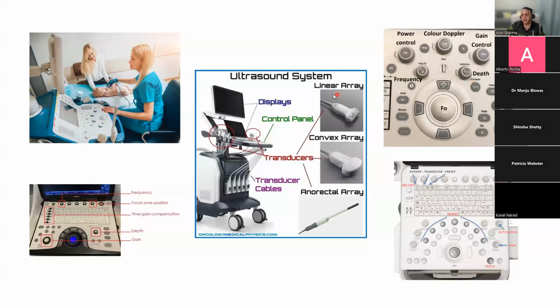But if you have a focus button, then really the focus button is usually, when you start in coronal plane, placed at the level of the corpus callosum or the ventricular system. And in the sagittal views, what we normally say is we like it placed at the level of the ventricles. And that will give you reasonable resolution to be able to see both superficial and deep structures with the same probe used in both coronal and sagittal planes by keeping the focus at the level of the ventricular system. If you feel that you want to see meninges in the more superficial areas, then you can change the focus to the more superficial region, and that will basically change your marker on screen, and I will show you that. But it might be better for you to use a linear probe with a higher frequency to be actually able to do that. Any questions about buttons?